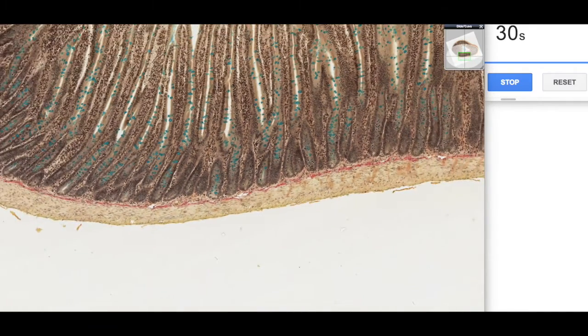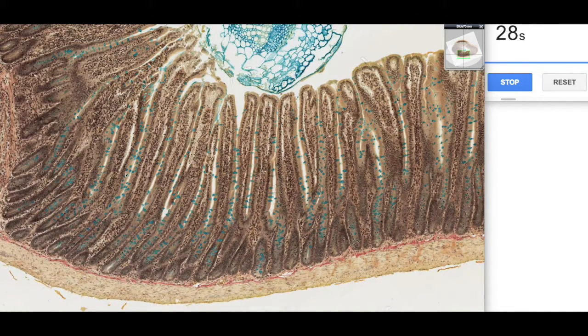Anyway, I thought that was quite an interesting one to look at the distribution of goblet cells within the small intestine. They increase in number as we go from the duodenum to the jejunum to the ileum. Of course, as the contents of the small intestine migrate down, more and more material gets reabsorbed, and we get whatever is left over that eventually becomes feces. So it needs a little bit more help getting through the gastrointestinal tract to reach a peak within the large intestine.